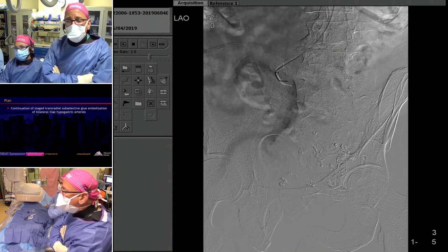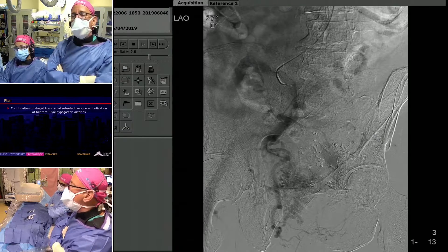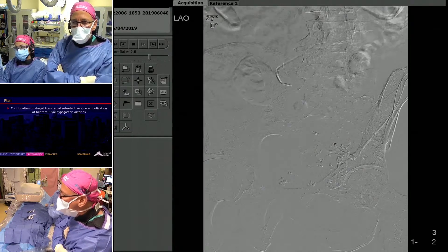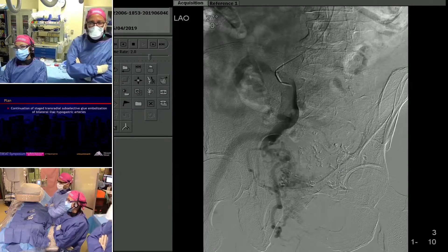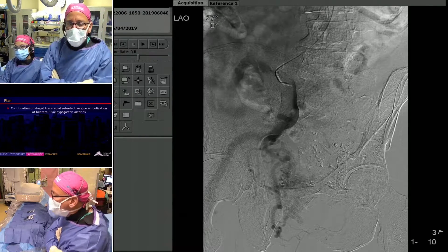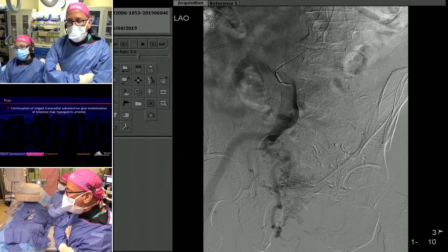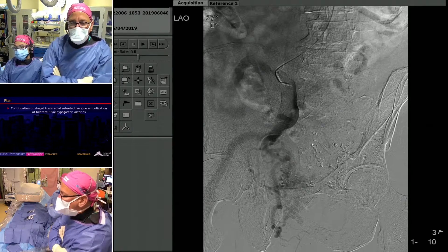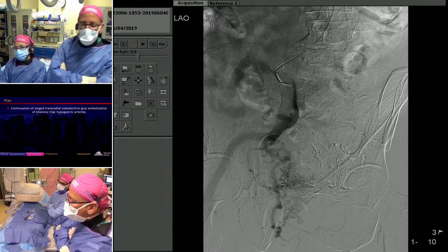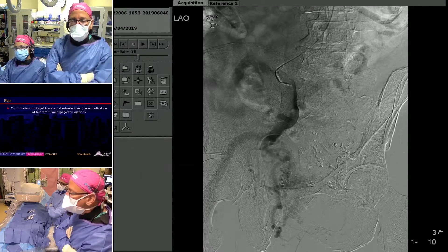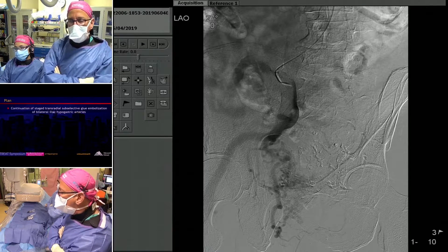We actually started this case by trying to put a guide system all the way down into the right hypogastric. The patient is actually somewhat tall, which we found out the hard way — this was our 125 catheter in the common iliac artery, and we were really not able to visualize anything here. Our target was the right internal iliac artery, and there are a number of named branches off the pelvis here.